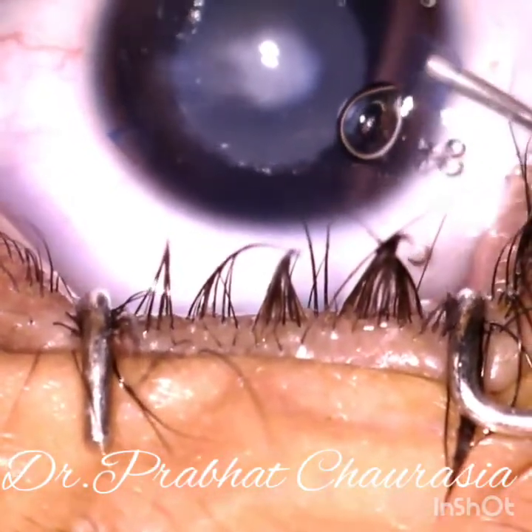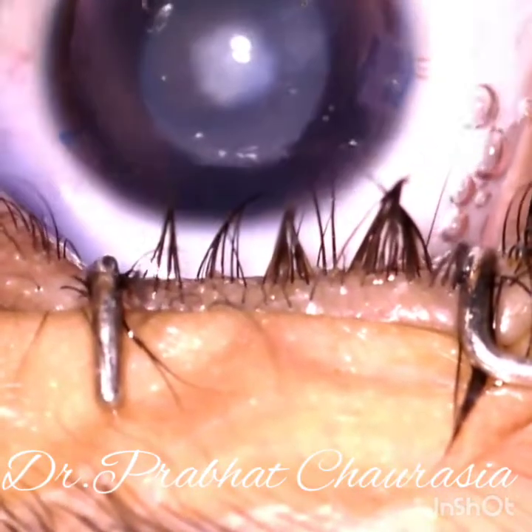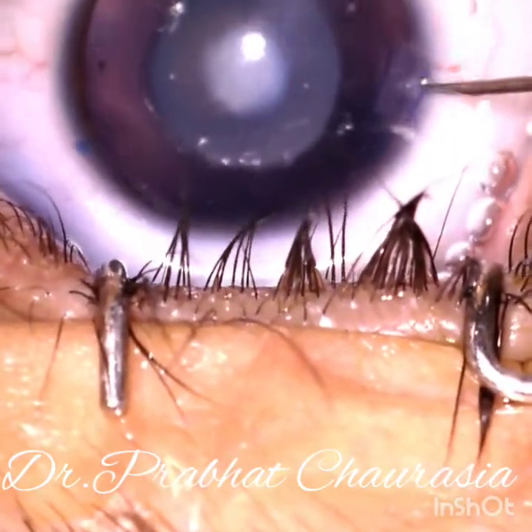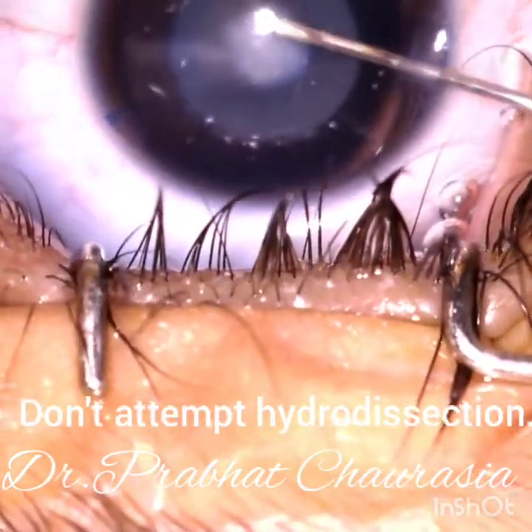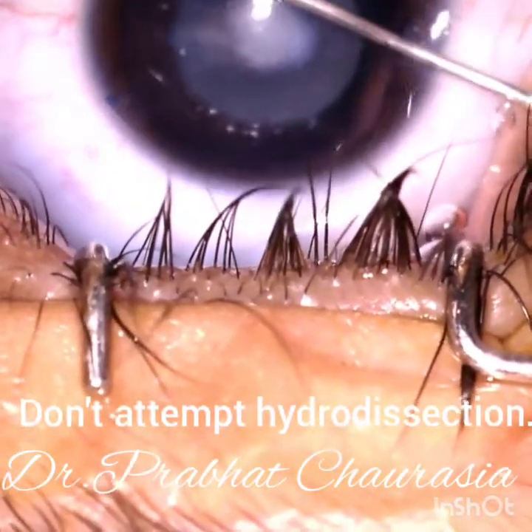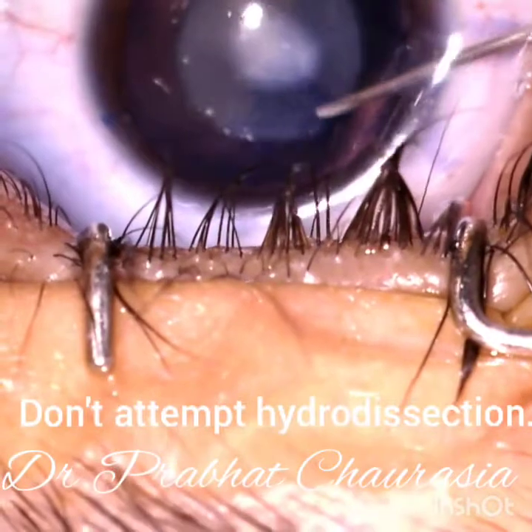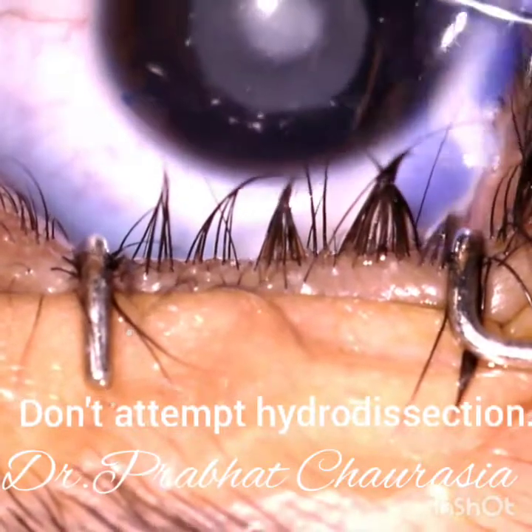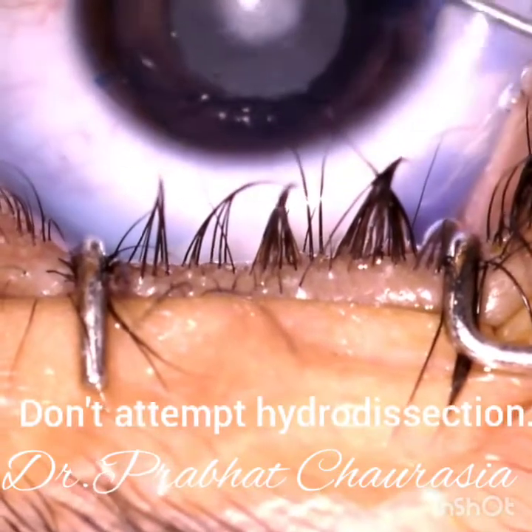Start the rhexis. Always make a small size rhexis in such cases — do not attempt hydrodissection. This rhexis is almost 4 to 4.5 millimeter in size, so if PCR occurs, we can implant the IOL in the sulcus.